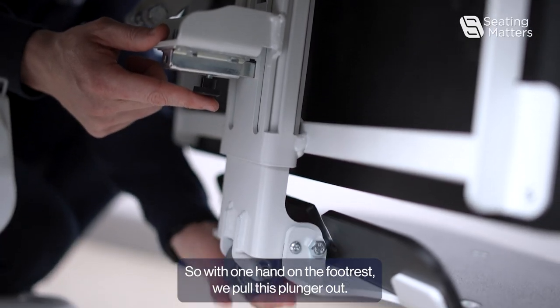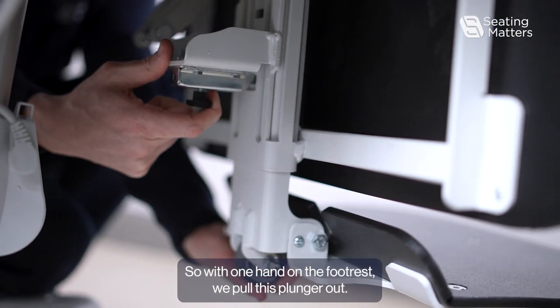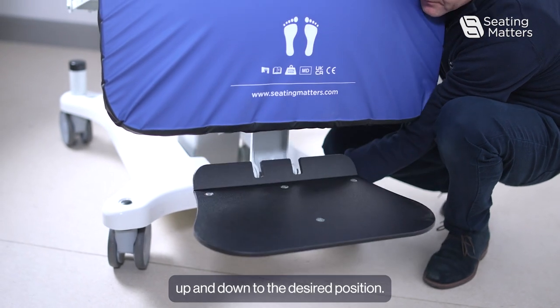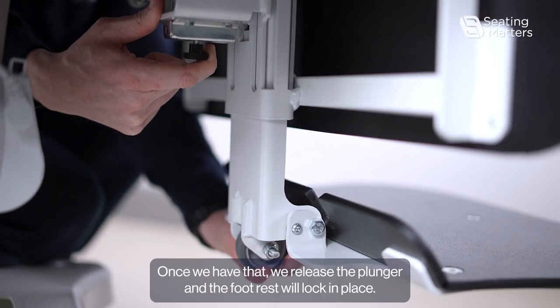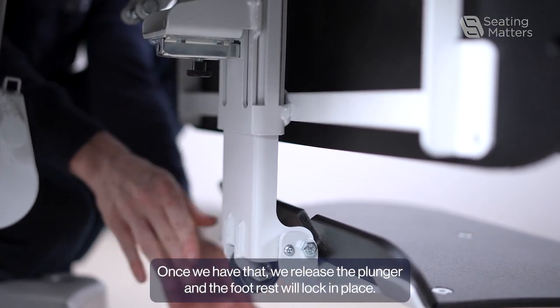With one hand on the footrest, we pull this plunger out. That allows us to move the footrest up and down to the desired position. Once we have that, we release the plunger and the footrest will lock in place.